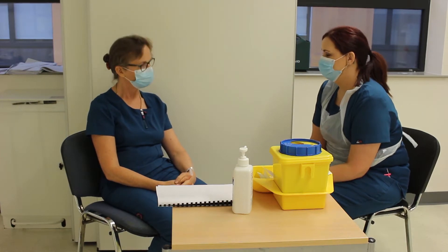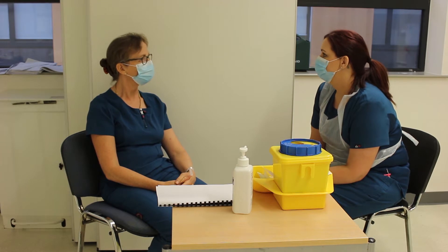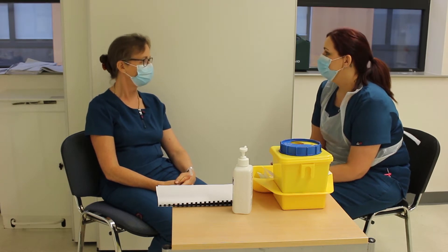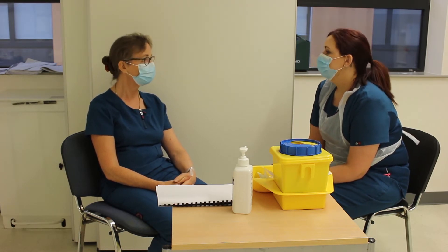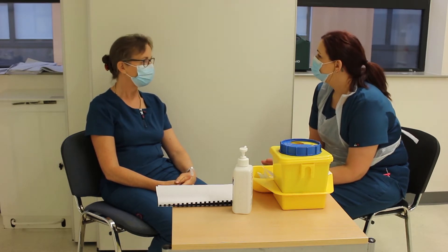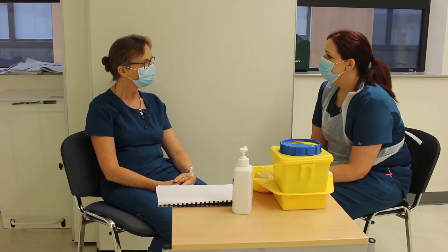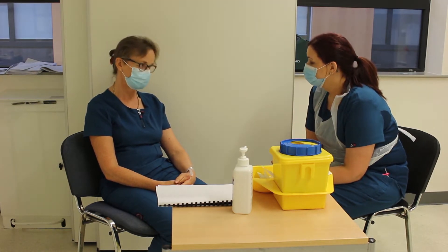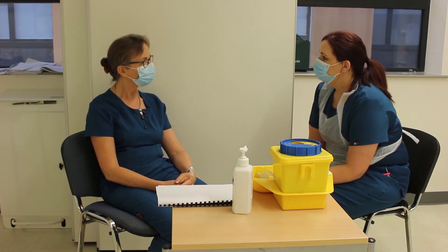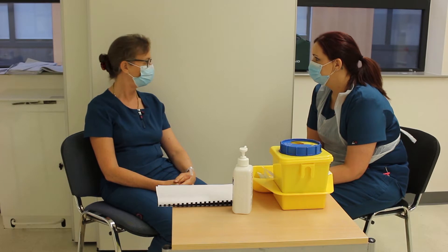I've been asked by your doctor to take some bloods. He wants to check your renal bloods and your hemoglobin. Would it be okay if we did that? Yes, sure. Have you any allergies to any medication? No. Any plaster or band-aid allergies? No.